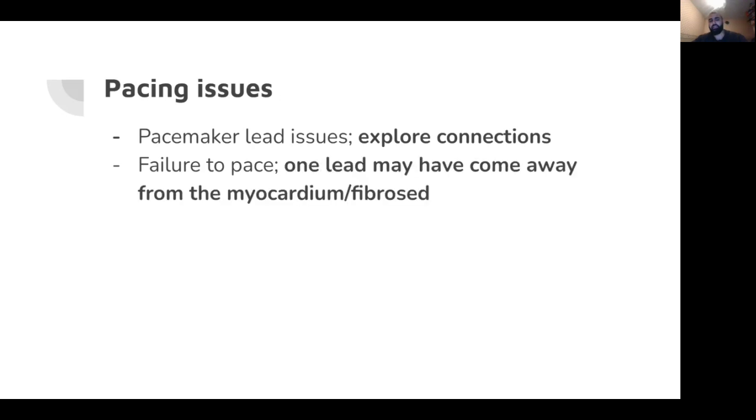You can get failure to pace. This can come over time as the pacing wire is stitched into the ventricle. If you're leaving it in for 4 or 5 days, then at that connection you can get some fibrosis. Or maybe as the patient's moving, that lead is pulled away and it's no longer in contact. In which case, it depends on the specifics of the situation. If the patient's in heart block and you completely can't pace them, then they may need to get a pacemaker.